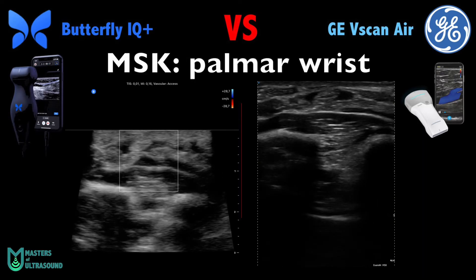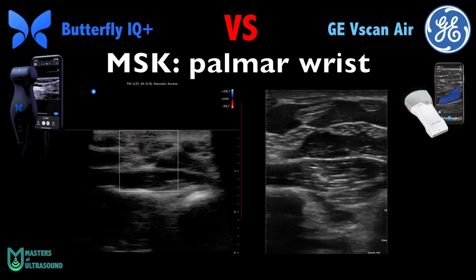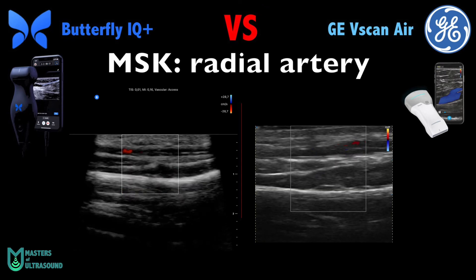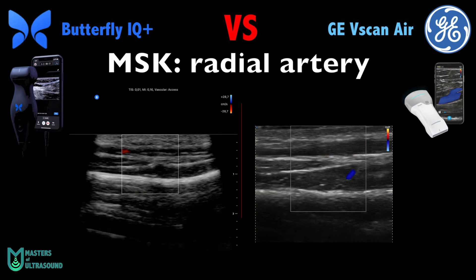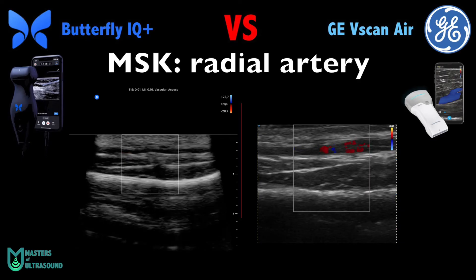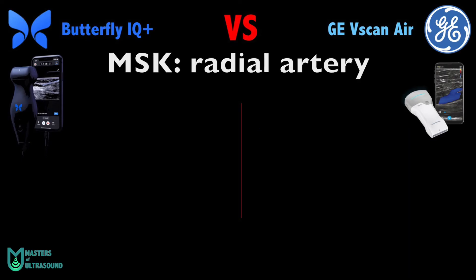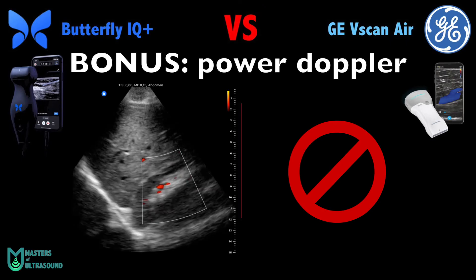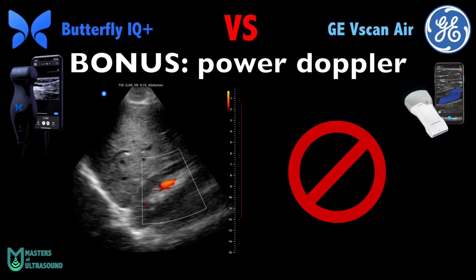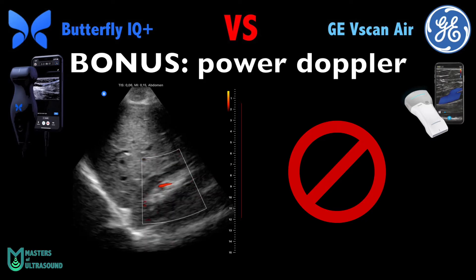In musculoskeletal imaging, both are pretty similar — maybe the Vscan is slightly sharper, but it's hard to say. Here is the radial artery color Doppler. Both Doppler sensitivities appear to be at the same level. As a bonus, the Butterfly IQ has Power Doppler mode, which may be useful for detecting arthritis.